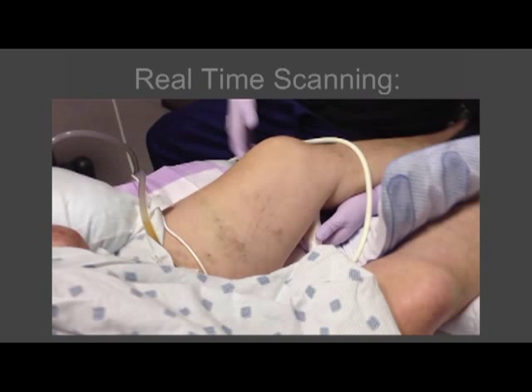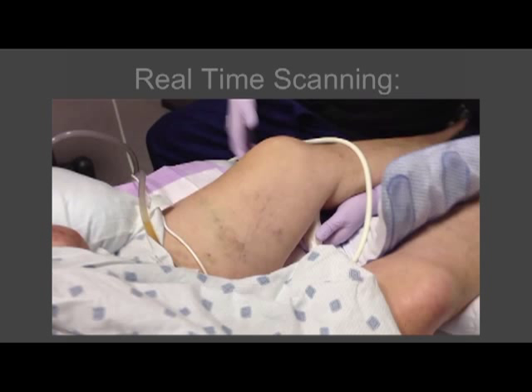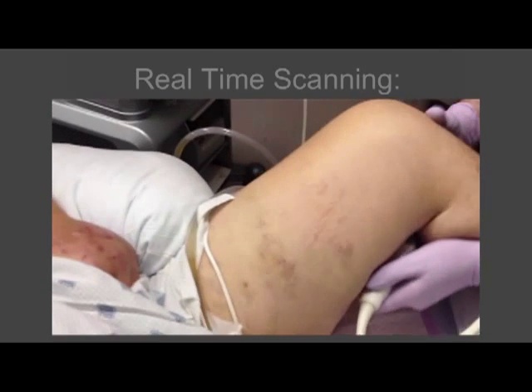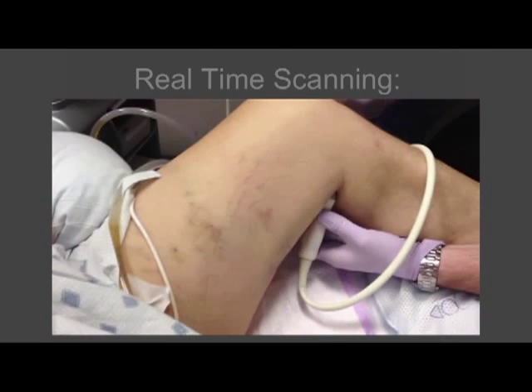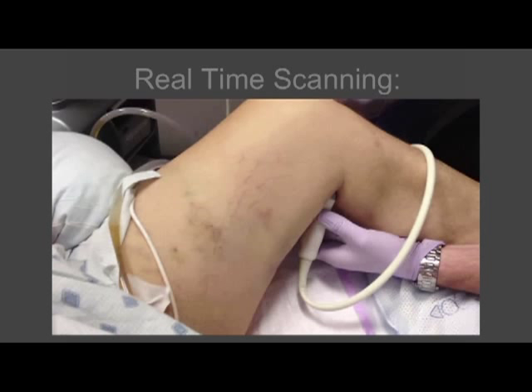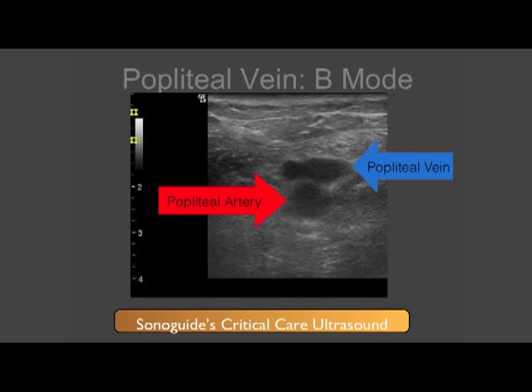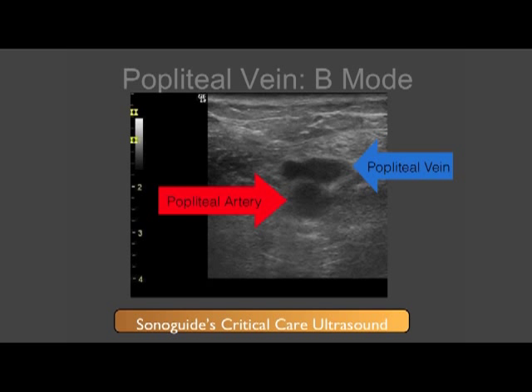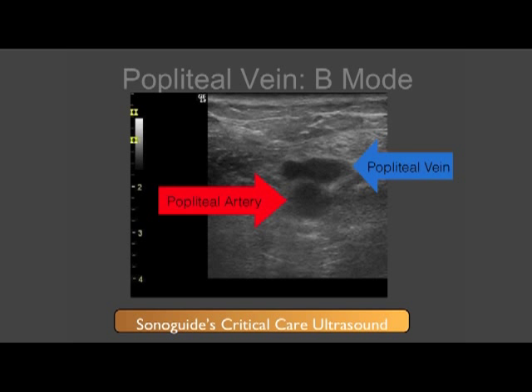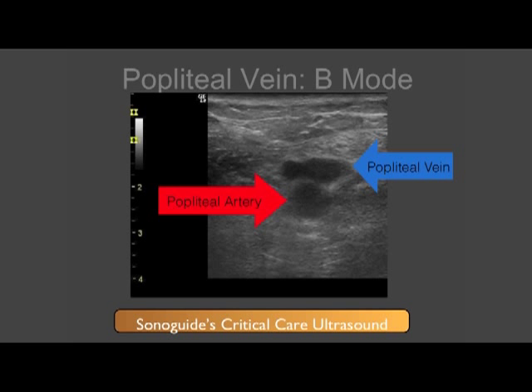Moving distally down the leg, I will now perform scanning in the popliteal fossa looking at the popliteal artery and vein. You can see that I have externally rotated the patient's leg and flexed it at the knee to gain exposure to the popliteal fossa. You will find the popliteal vein is more superficial or posterior compared with the popliteal artery.